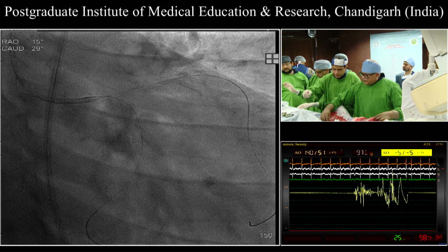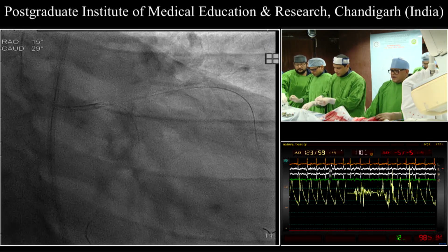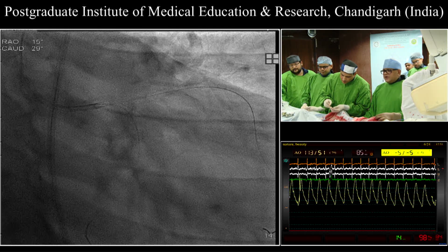Okay, OCT. So let me see the result of the cutting balloon and also the non-compliant 3 millimeter balloon across the in-stent restenosis by repeating the OCT imaging.